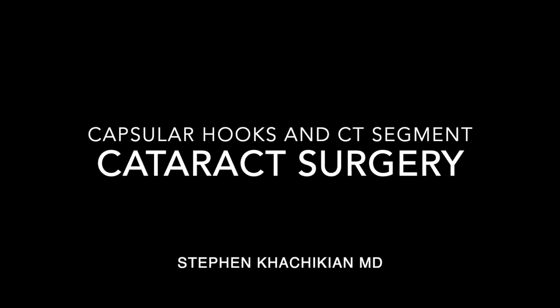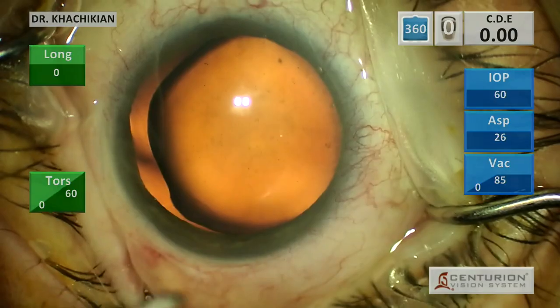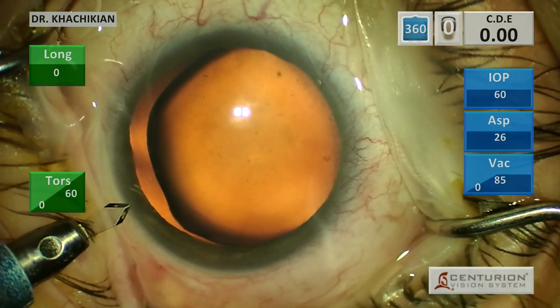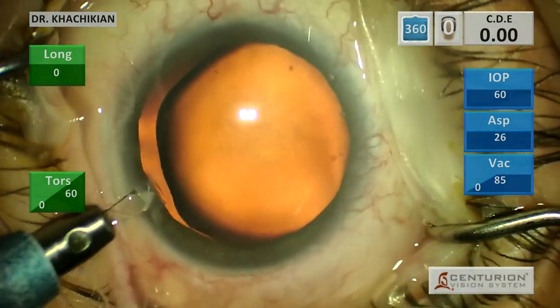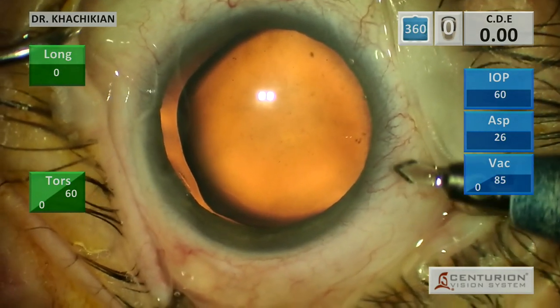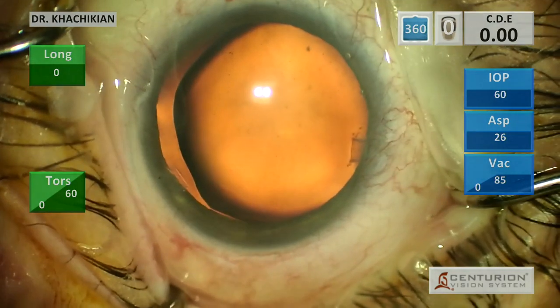Good afternoon, everybody. It is Dr. Stephen Kachikian from the Black Hills Regional Eye Institute. Today I've got an interesting case of a partially dislocated, inferiorly dislocated lens, likely due to weak zonules.